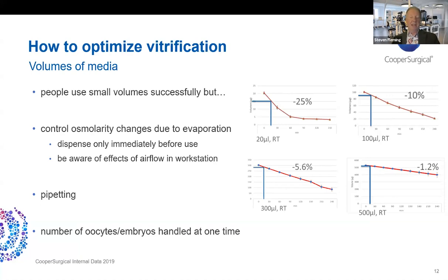So if you're starting out, it's actually probably better to start with large volumes until you achieve satisfactory results before making any changes. And of course, if you make changes, you should make them one at a time.